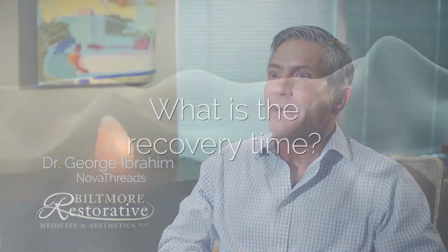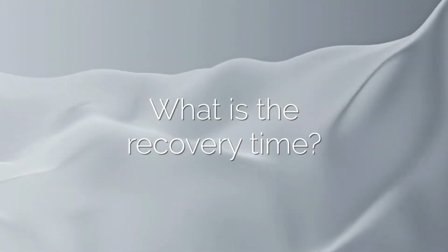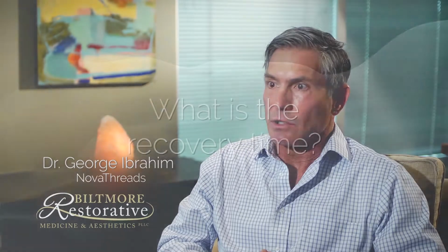What it essentially does is tack up different parts of the skin that seem to have fallen over time. If you place these threads in a certain fashion, you will create more collagen that will build up fine lines and smooth them out. There's very little bruising when we do this, if any. There's essentially no downtime. Patients will feel some discomfort during the procedure and for a day or two afterwards. Nothing that limits them, really, with anything.